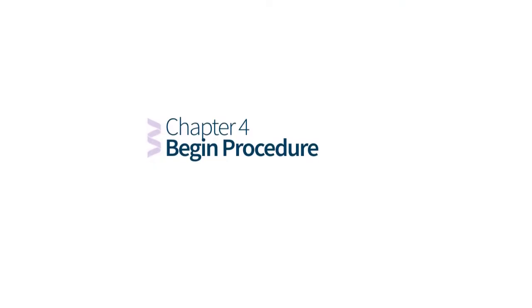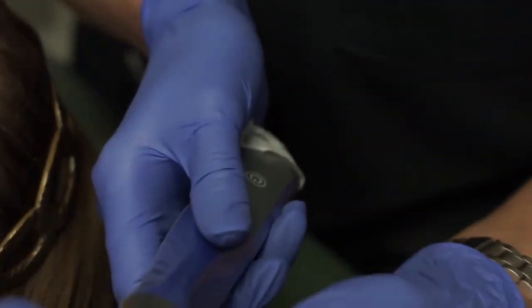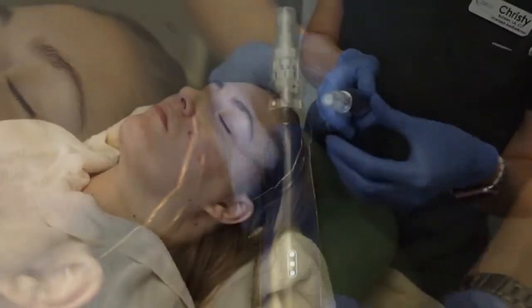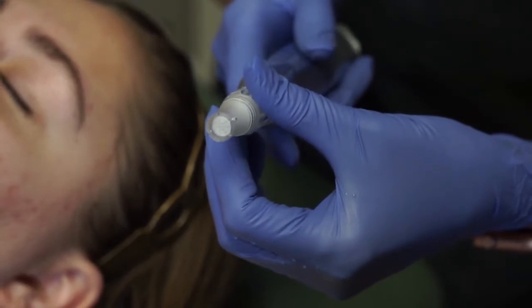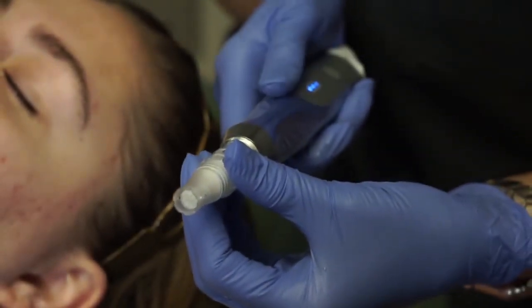Begin procedure. Ensure the depth is set to 0 and power on the device by pressing and holding the power button for 2 seconds. Adjust needle depth settings on the SkinPen cartridge by twisting the depth cup. New settings will be indicated by a click into place.